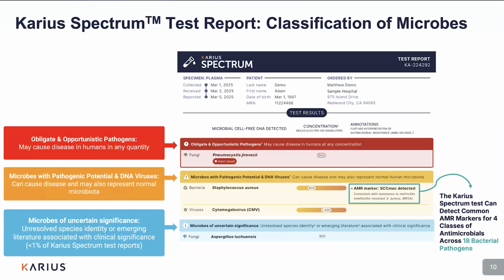And so they should not be ignored or designated as irrelevant. So they warrant further investigation and to be acted upon. The second category of organisms is the one in the yellow box.